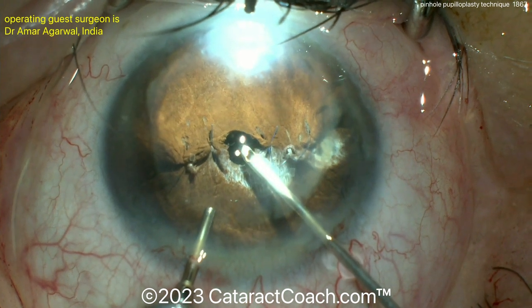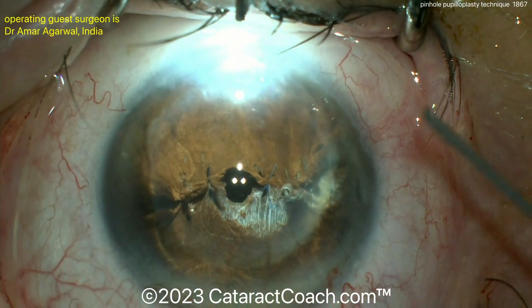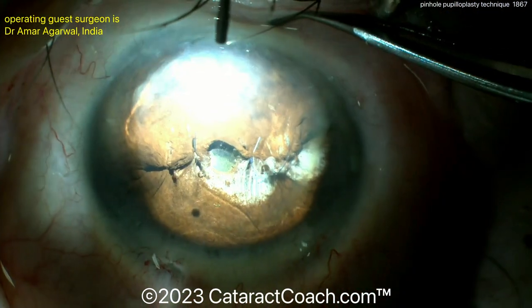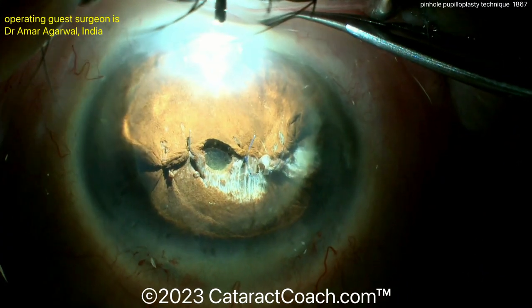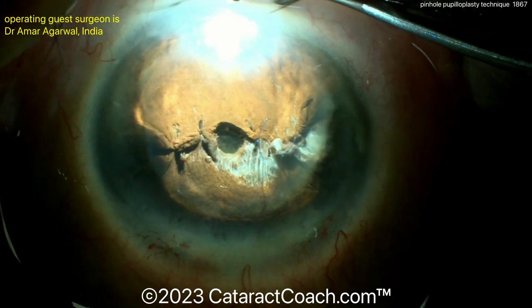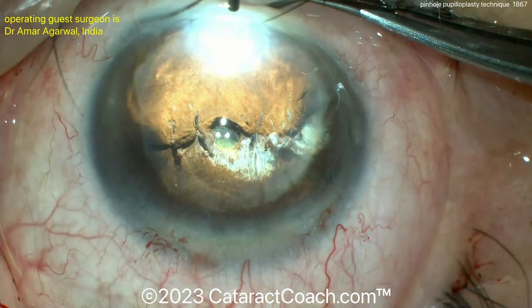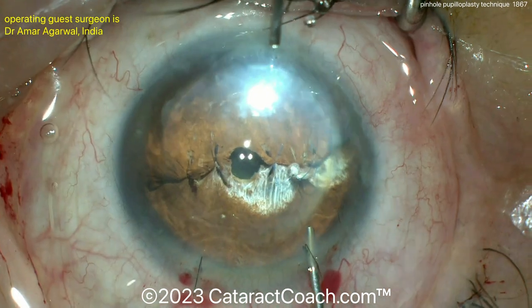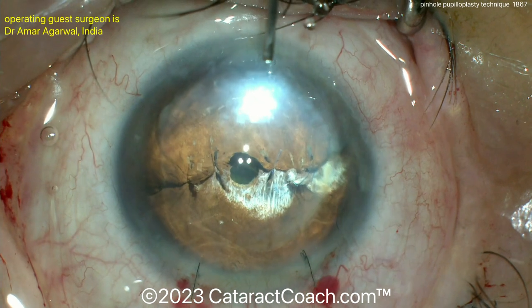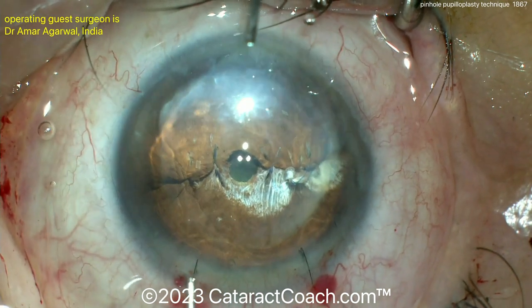The patient is going to be very happy with this. You can still examine the retina using wide-field imaging devices that we now have, though this will limit examination of the real periphery to a degree. But it improves the patient's vision dramatically. You can see that beautifully centered small pupil. The results for this patient were absolutely spectacular. This is the four-throw pupilloplasty technique — a pinhole pupilloplasty.